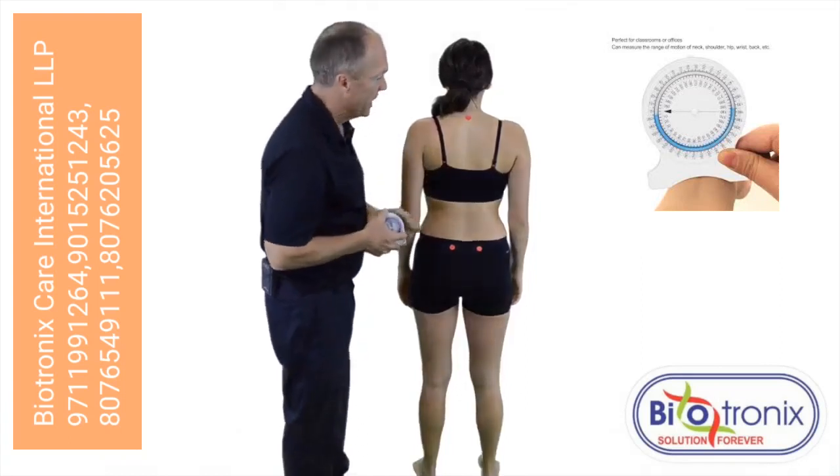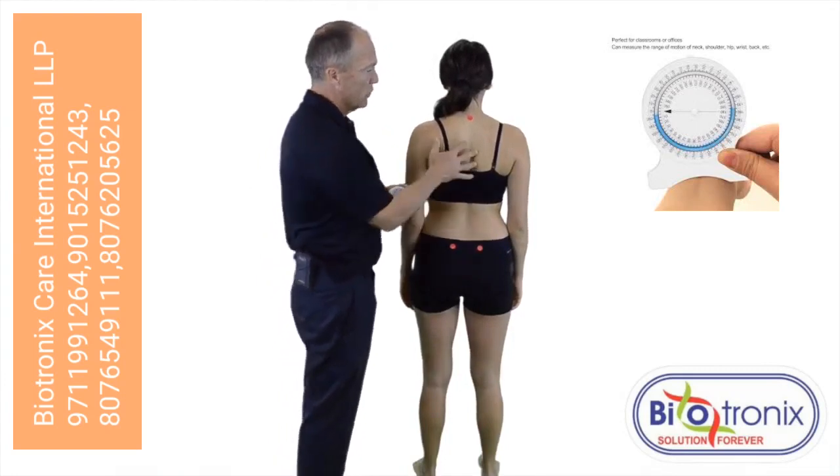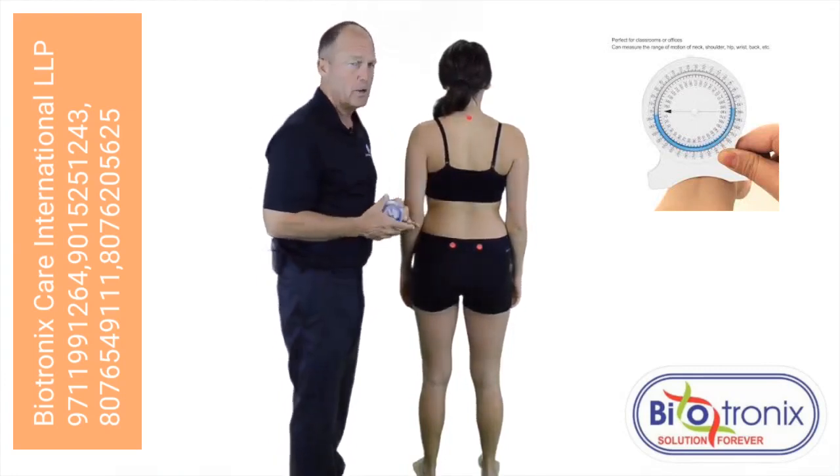In this position, with the patient standing in a more balanced stance position, we're now going to measure for thoracolumbar flexion using an inclinometer device.